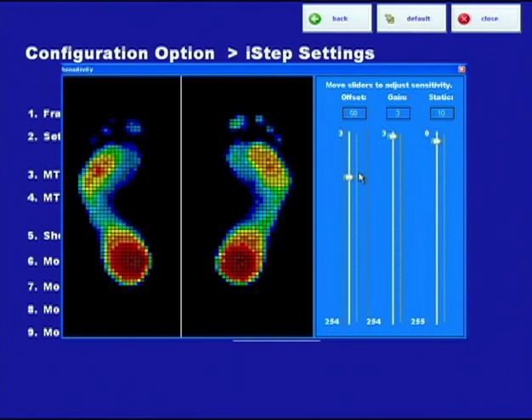The gain really just enhances the offset. The gain is a way to work within a certain offset or sensitivity setting. You hardly ever need to adjust the gain. We keep it typically at three, sometimes a little bit higher. But if you move it, you'll see it also impacts the color, though a lot less than the offset does. These are more subtle enhancements to the image. We're really breaking it down to give a lot of flexibility to get the perfect color.